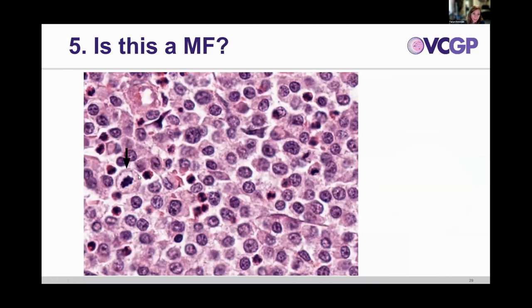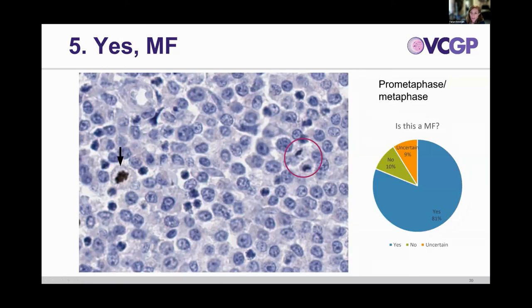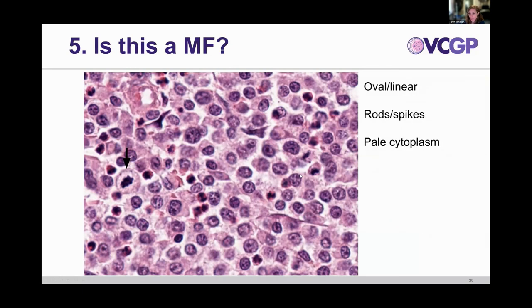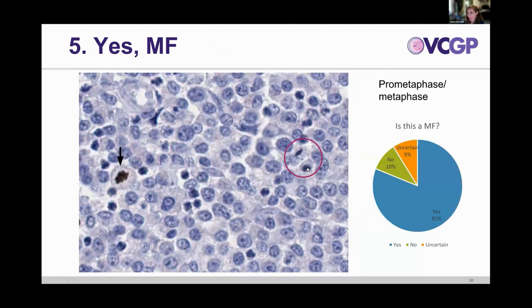Number five: the arrow points to a structure that is hyperchromatic in the center, very irregular, spiky, with a pale cytoplasm. The vast majority said yes — and yes, it is a mitotic figure. Going back you can also see a nice telophase: these two cells are separated, but using the one-cell-width guideline, you would count this as one structure. This telophase is also not staining with PHH3, which makes sense.